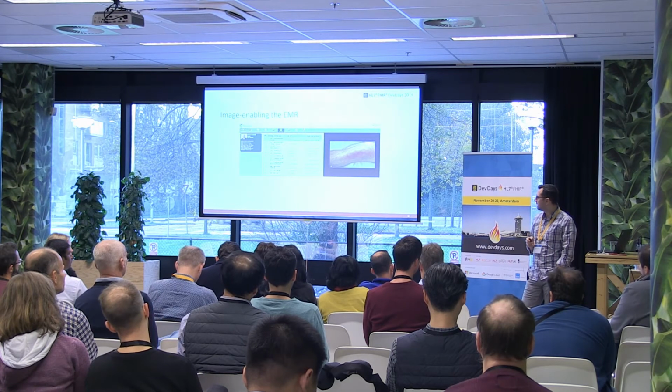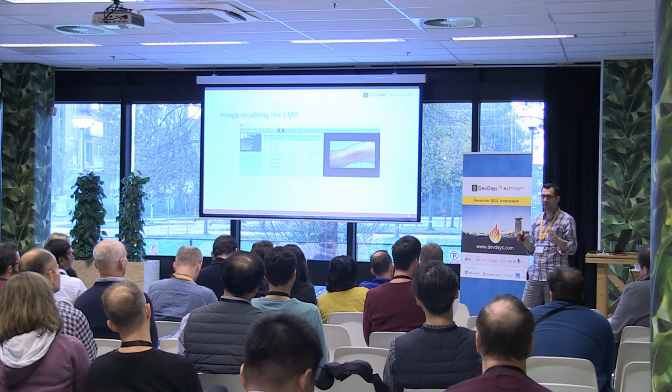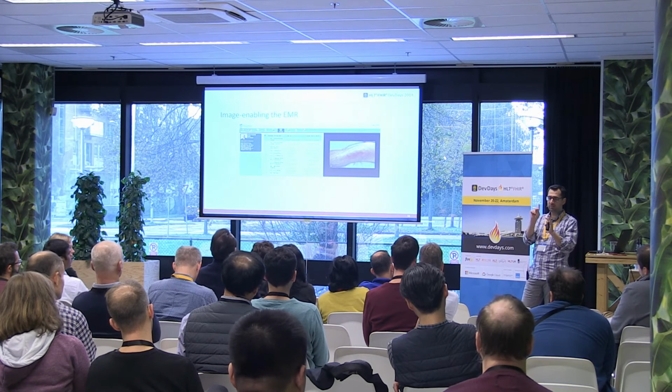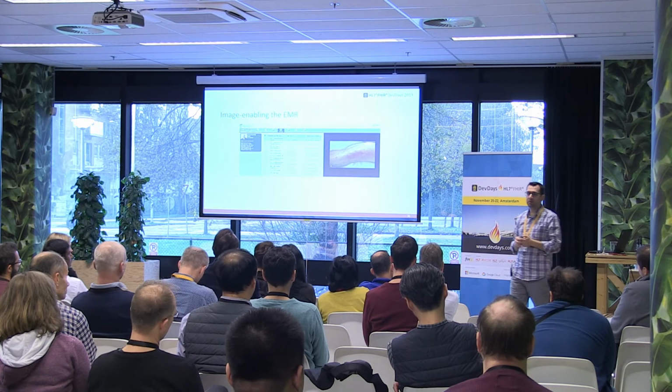There is definitely a big trend, and actually I feel like we're probably at the bottom of the trend. I feel like everybody is now image enabled. So every EMR is now somehow integrated with an image viewer, whether it's embedded or just simply a link that opens up a new browser window or something. It's a very common thing nowadays.